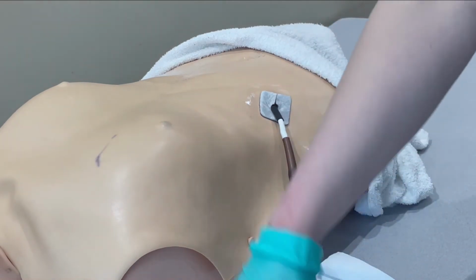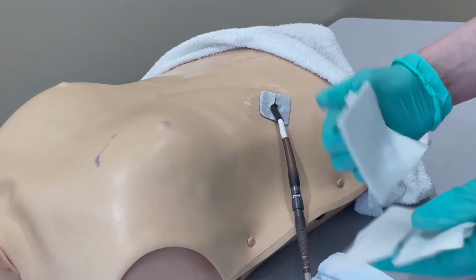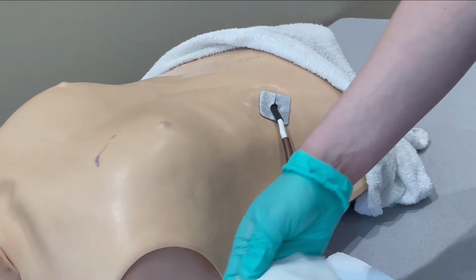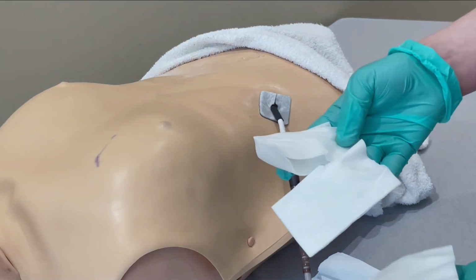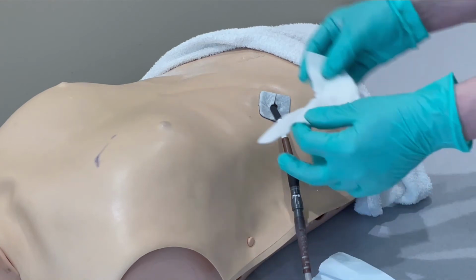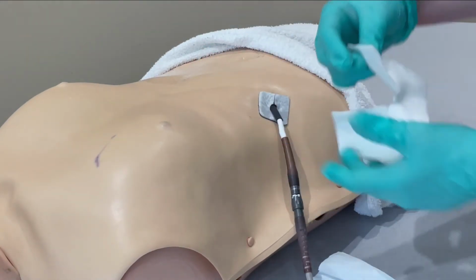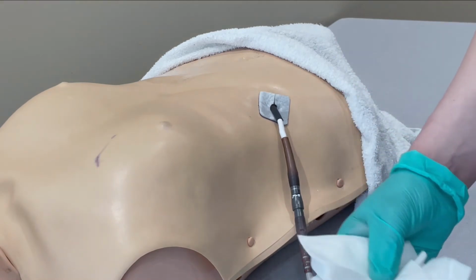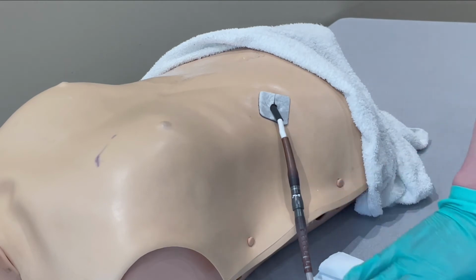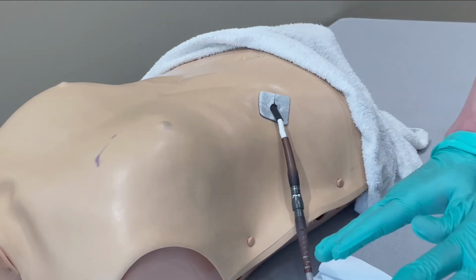We do have gauze in this kit. There's 2 slitted gauzes, and then there's 1 non-slitted gauze. These gauzes are just optional. If your family member had an infection or had some bleeding, you can utilize the gauze by putting it around the site like so. If your family member's site is healed and it has no drainage present, it does not require gauze. So go ahead and leave that off to allow the site to breathe more easily.